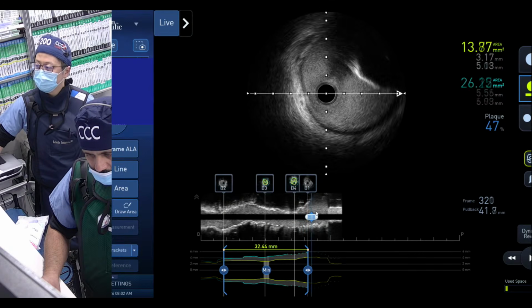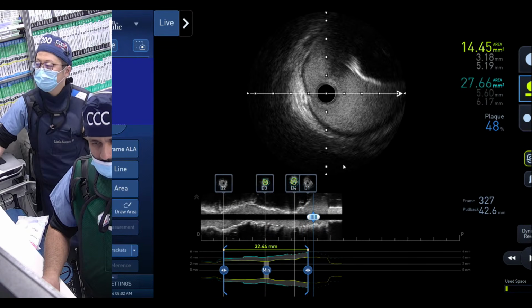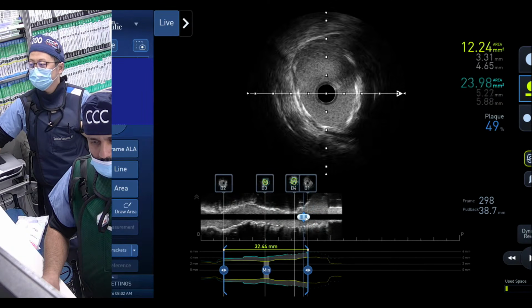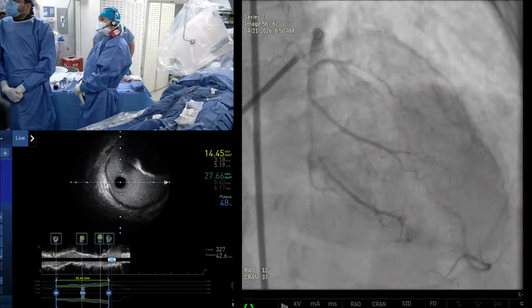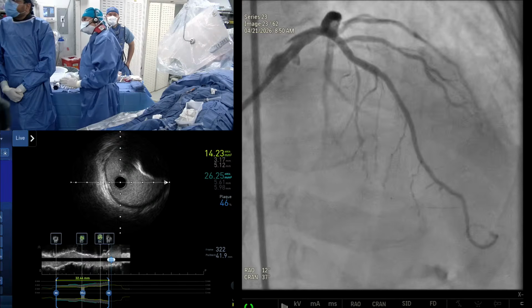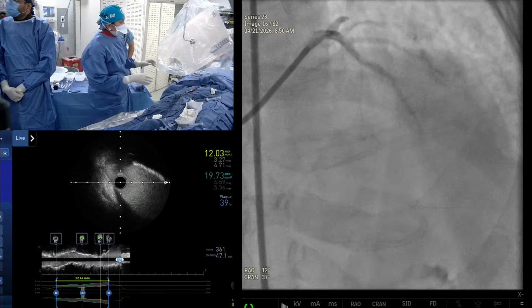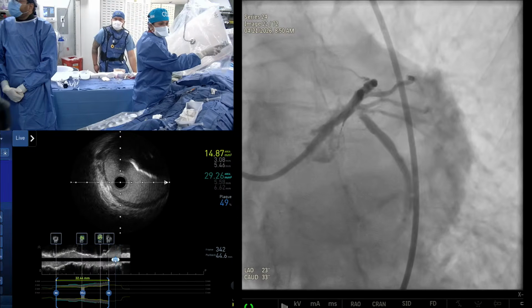So yeah. What was the POT? 4.5. POT was done with a 4.5. He says it's almost a 5.0 vessel, 5.5. That's right. We still went lower. I'll tell you one thing I would have done differently, but anyway, you have to look at the angiogram. Now look at the angiogram. Wow. Pristine. Yeah. No, there's a proximal... Look at that little dissection there. So we've gone through multiple views. Okay. But more important, why did we not see it on the angio?